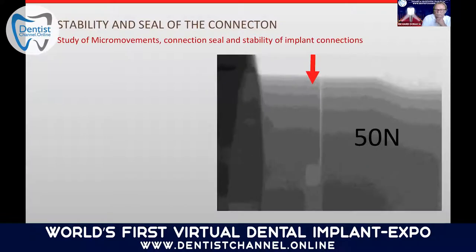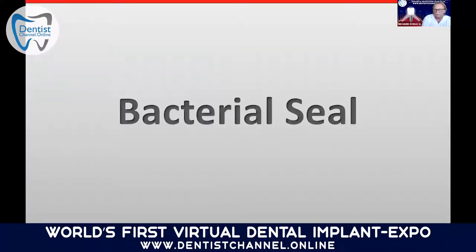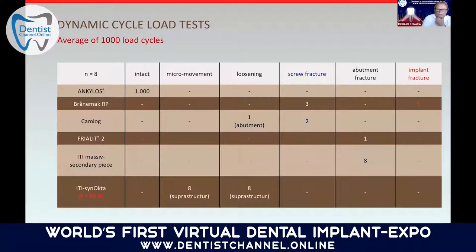You can see here that with the load forces, automatically then in a lateral force, the more forces you put on, the wider the implant and abutment connection is going to get, especially on flat connections. The bacterial seal, or the micro gap, is also what they looked at. Average loading was about 1,000 cycles, and taking the main manufacturers, you can see the main problem was screw fractures. Abutment fractures were also a problem, and even some implant fractures were taking place.